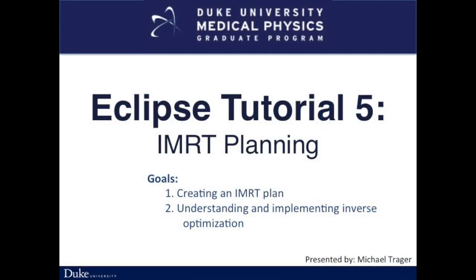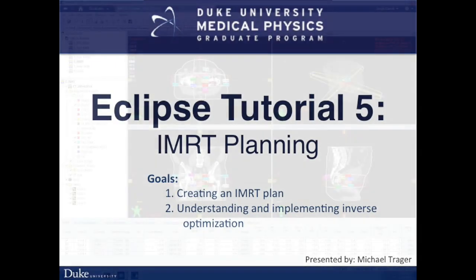This is the fifth video of the Eclipse tutorial series, IMRT planning. In this video, I will discuss how to create a plan with inverse optimization and the optimization interface and functionality.